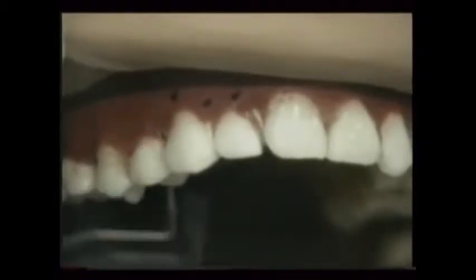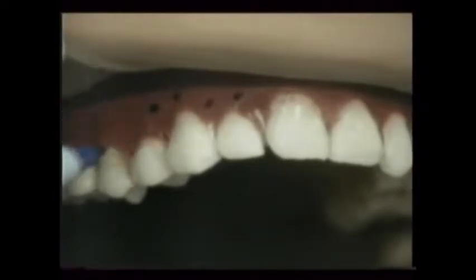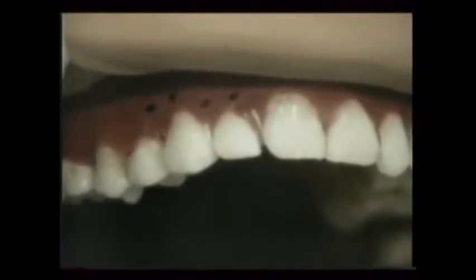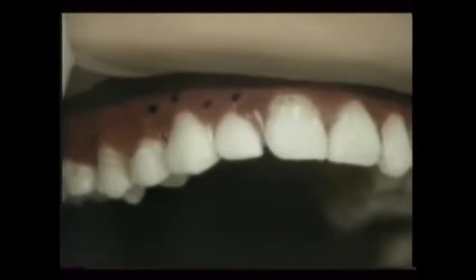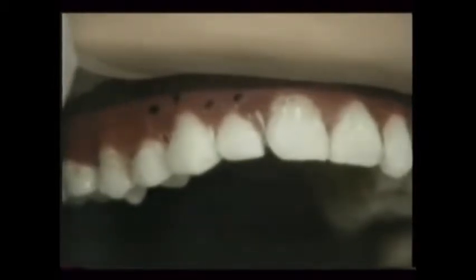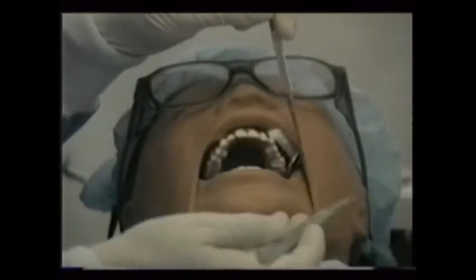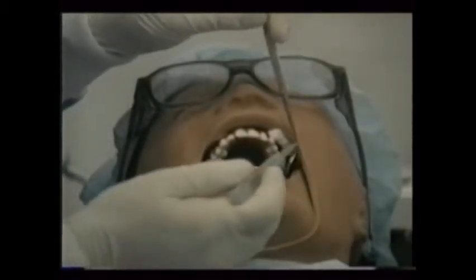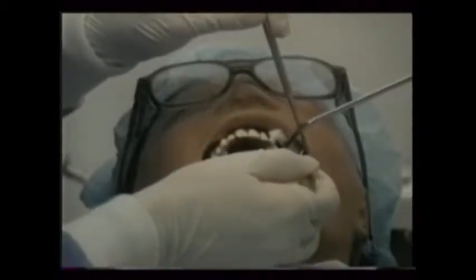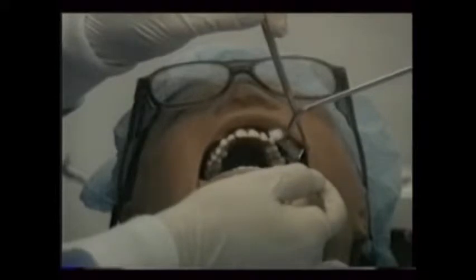Alternatively, the periodontal probe may be inserted to depth, then removed and used to make the perforation in the gingiva, or marked as shown. An indelible pen might then be used to connect the dots and outline the periodontal defects that need correction. After isolating the area with cotton rolls or gauze, the dentist uses a scalpel or a periodontal knife to incise the gingiva adjacent to the teeth.